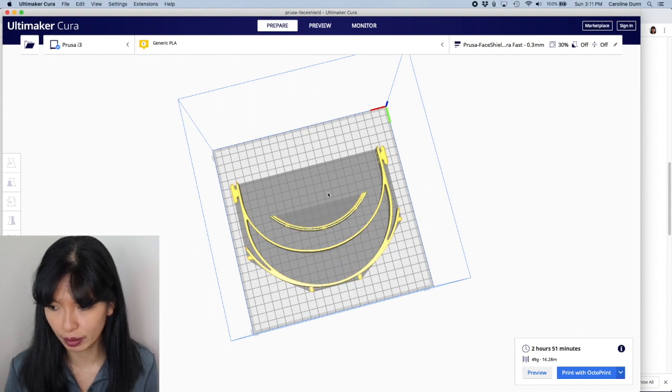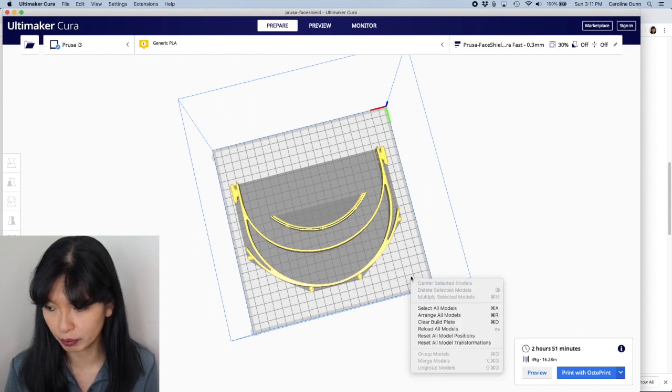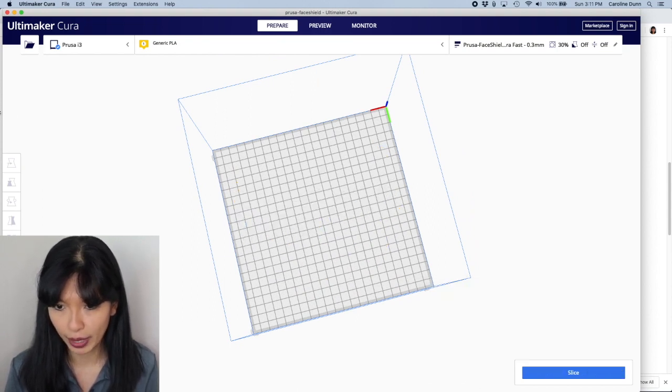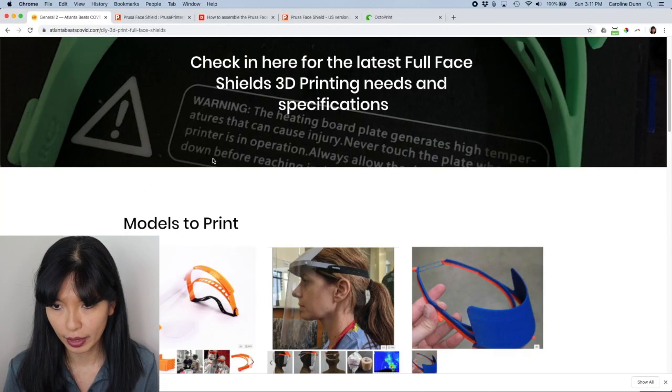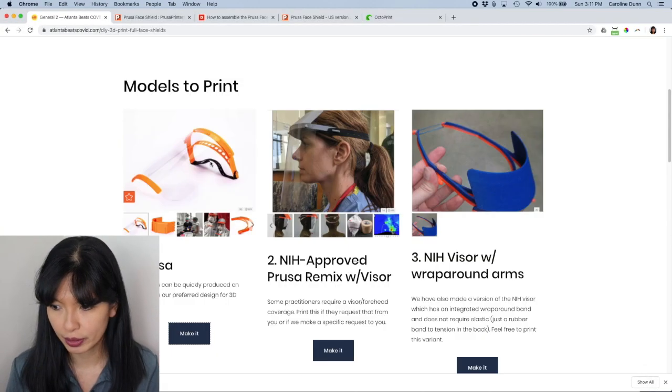And that is how you print the basic file. So those are the basic files. I'm going to clear my build plate now.